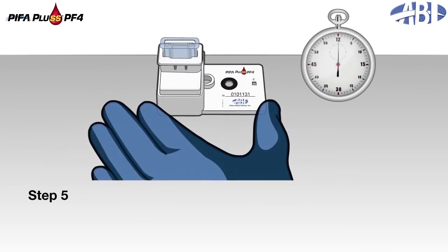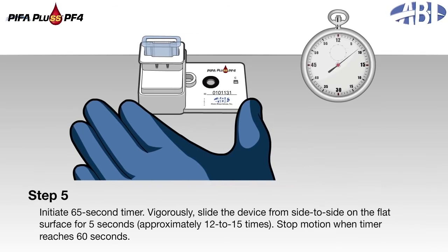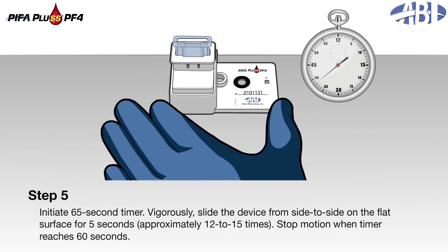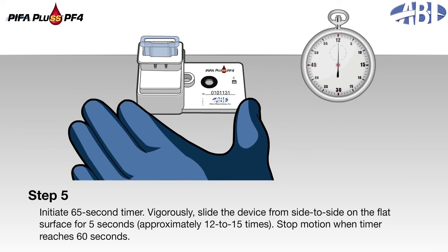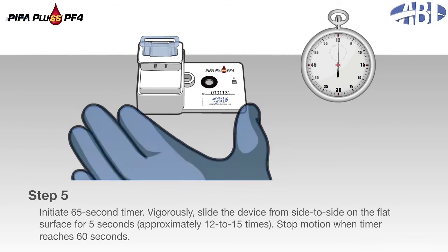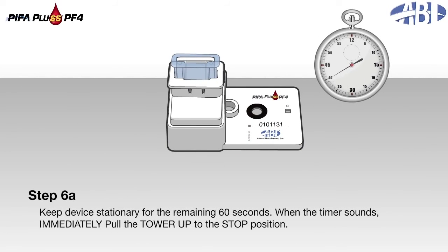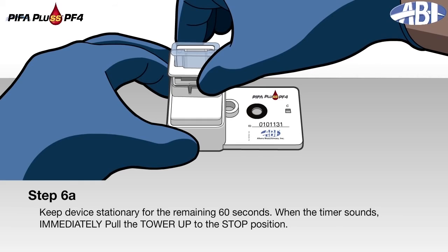Step 5: Initiate the 65-second timer. Vigorously slide the device from side to side on the flat surface for 5 seconds, approximately 12 to 15 times. Stop motion when the timer reaches 60 seconds. Step 6a: Keep the device stationary for the remaining 60 seconds. When the timer sounds, immediately pull the tower up to the stop position.